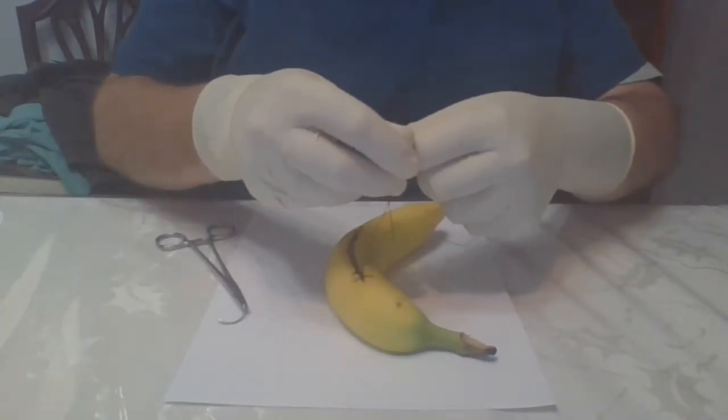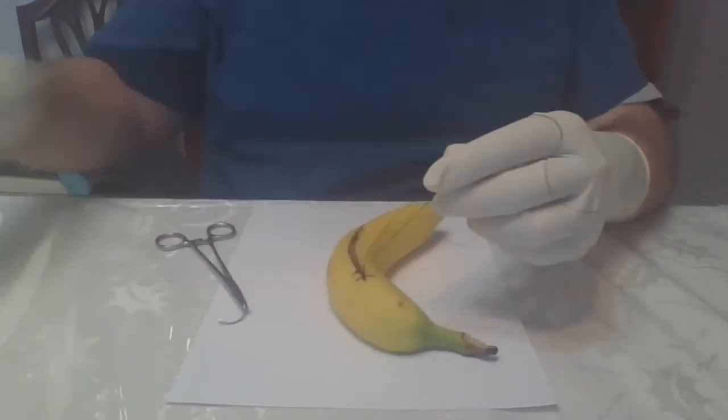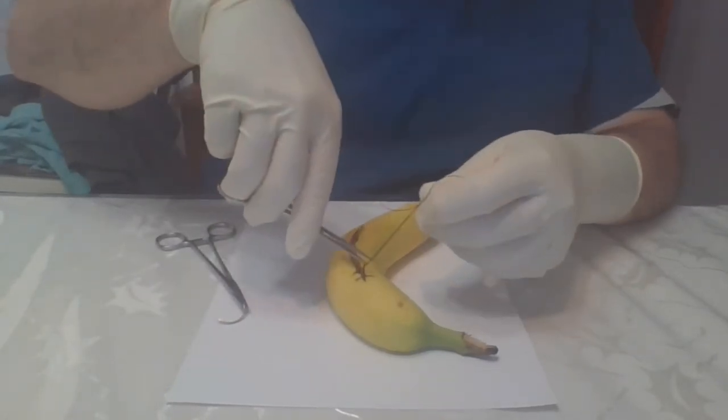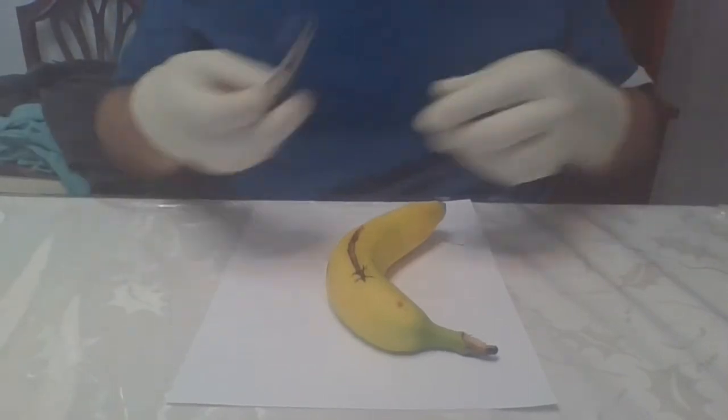Bananas are not the best for me to suture. I do better with pig's feet, as I tend to pull these through the skin of the banana. That one wasn't an air knot, but I did pull it through.